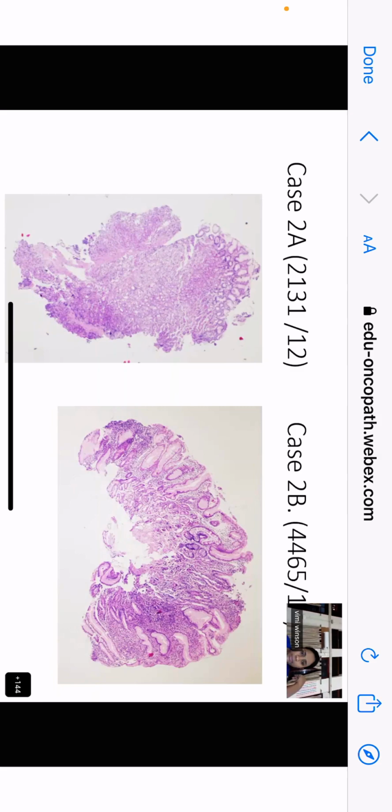So now please tell me on the left hand side, which part of the gastric mucosa is that? This is fundic, ma'am. Fundic means what? Is it the same as body? Is it like the antrum? Is it like the cardia? You don't know, no, ma'am.